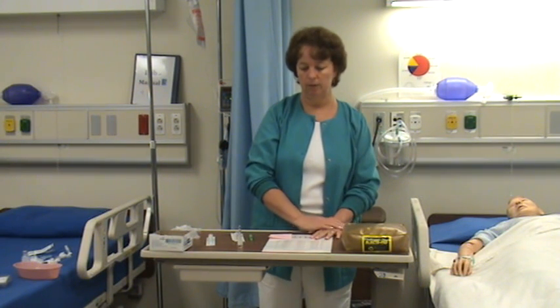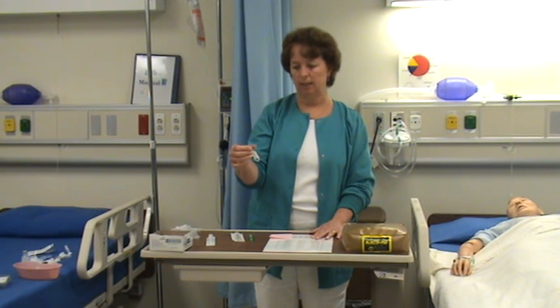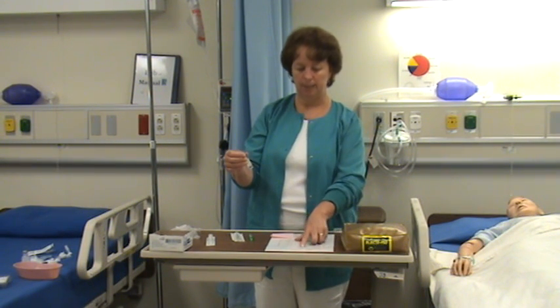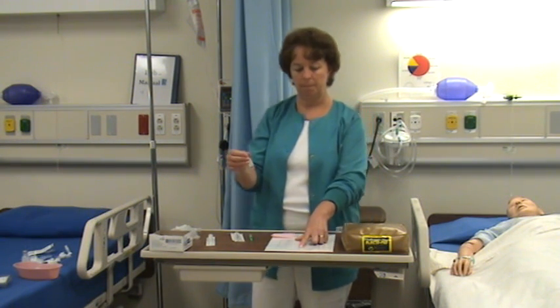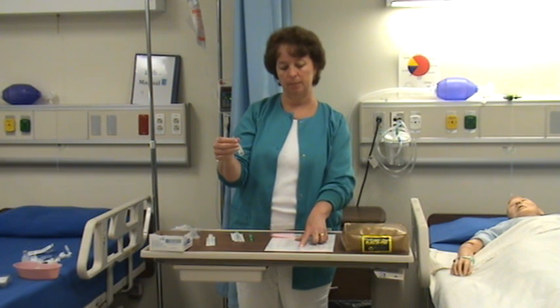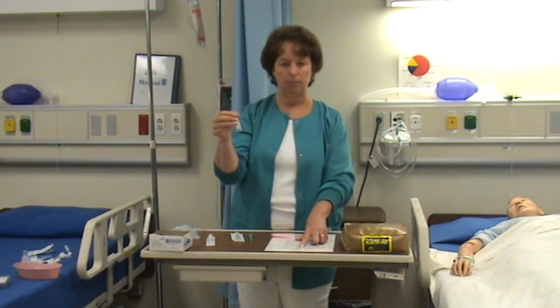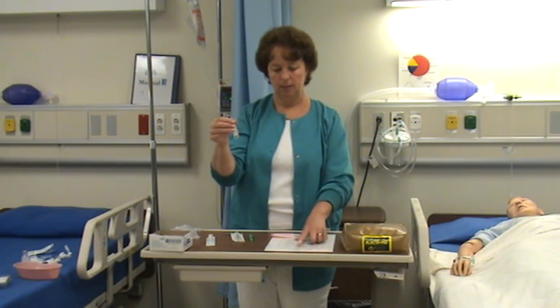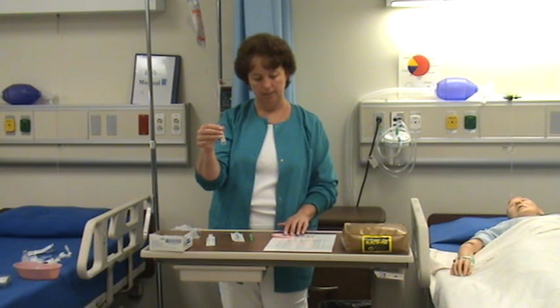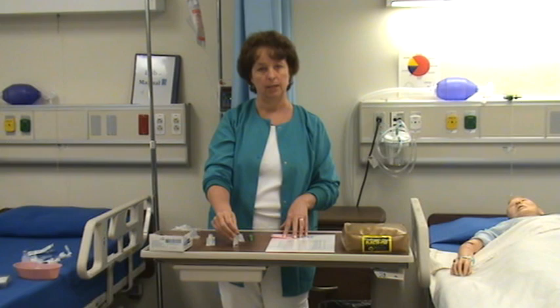So I first look at my order and do my first check — the five rights of the first check. I have drug B. The order is for 1.6 milligrams IM, and available I have an ampoule that has two milligrams of drug B per milliliter. So each milliliter has two milligrams and I need 1.6 milligrams. I do my calculation and come up with a dose of 0.8 milliliters to be administered to the patient.